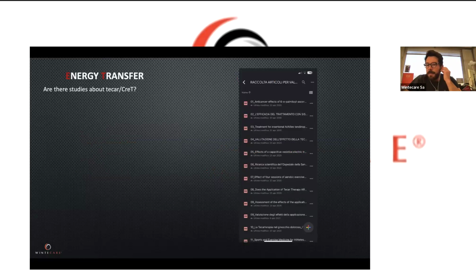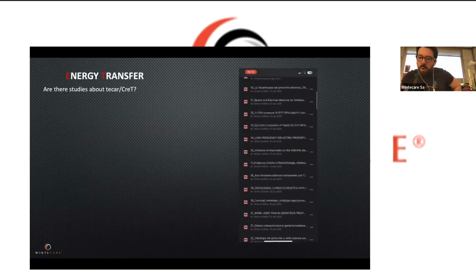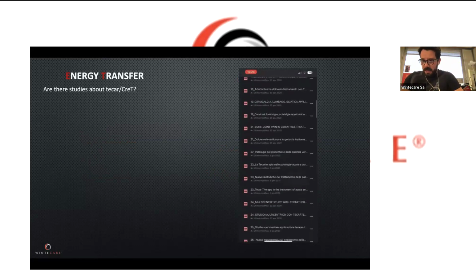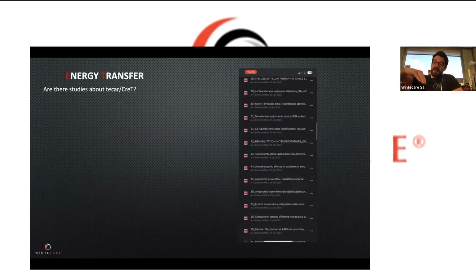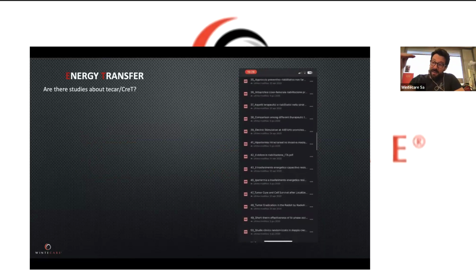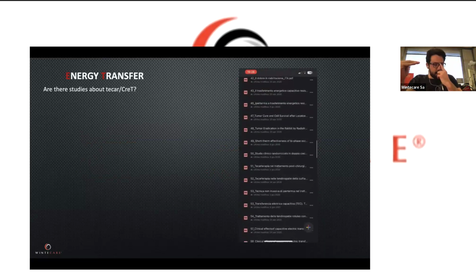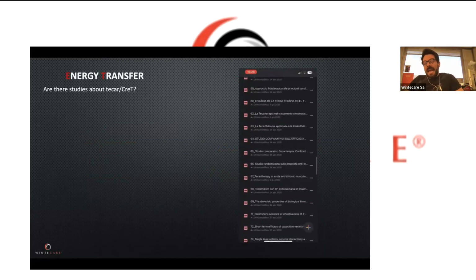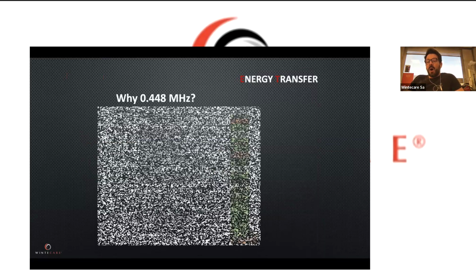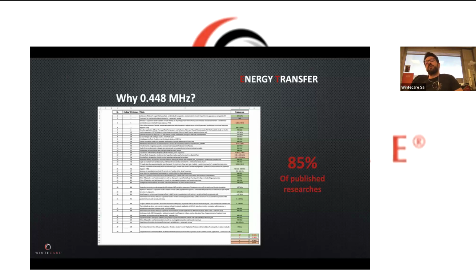Why 448 kilohertz and not other frequencies? Okay, if we analyze the folder with all the studies published so far on capacitive resistive energy transfer, and we make an analysis of them, so we need to download them, read them, check which device is used within that specific study, checking the frequency of the device, we will see that 85% of the studies published on impact factor reviews use devices with the 0.448 megahertz field.